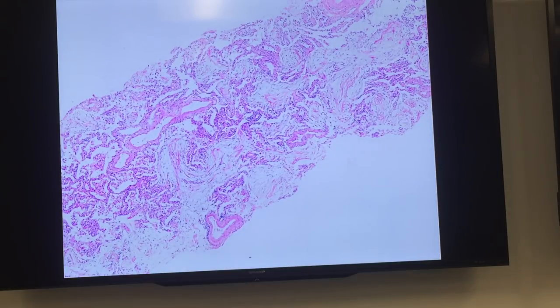All right, who's going to take this? Who else is first year now? Jessica, you want to do this? What's going on in this? It's a needle biopsy, isn't it? It is. Yeah. What's going on? So I'm seeing multiple fibroblastic proliferations. Multiple fibroblastic proliferations, correct?